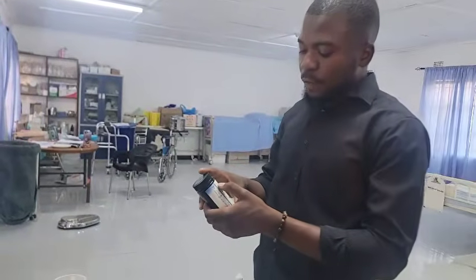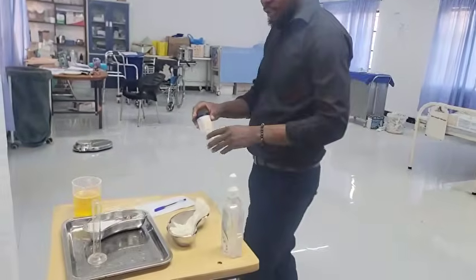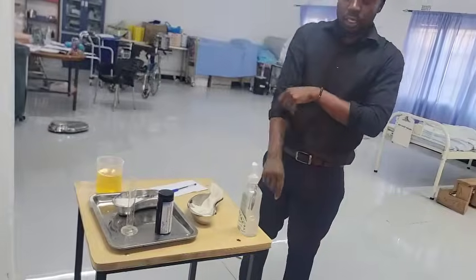Leukocytes. If the leukocytes come out positive, it may indicate that there is an infection, so there are some antibodies trying to fight off the infection in the body. Yes, so those are the interpretations. Okay, now let's begin the procedure.